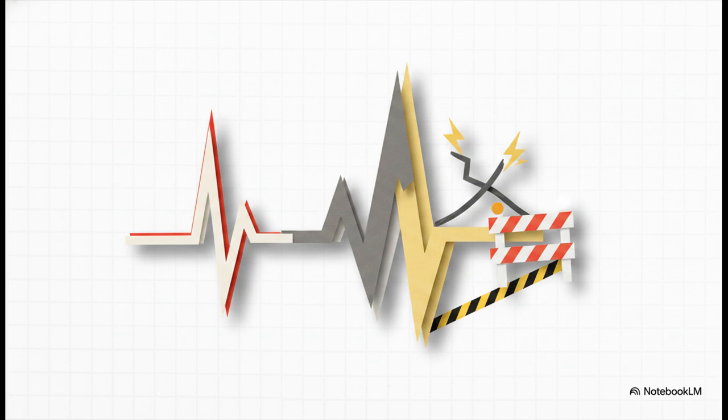This significant conduction delay indicates a complete bundle branch block. Basically, either the right or left bundle is failing to conduct properly, which forces the electricity to travel super slowly, cell by cell through the ventricular muscle.